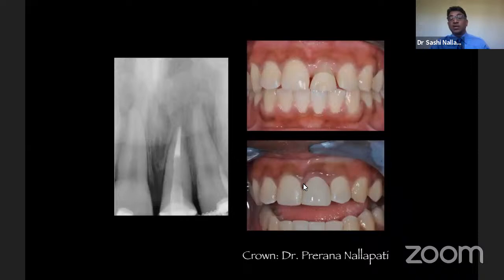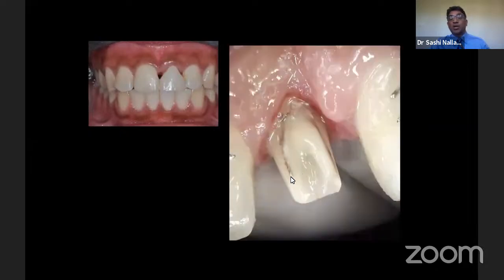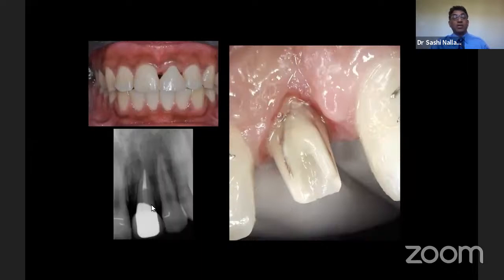And this is the attachment now on the buccal. So this is how we started out when the tooth was extruded. As you can see, these big gaps, but these are managed with the restorations on the lingual temporarily, obviously. And then of course you have all of this crack now fully exposed to the mouth. So there's no part of the root under the attachment that is cracked. So now there is a new restoration, a new crown.